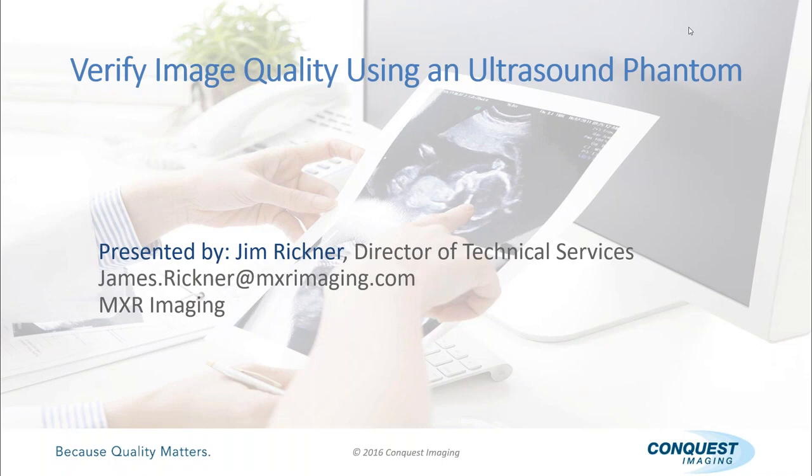And then I had the junior engineer come in from the group and perform his PM testing. Now we're an ultrasound company, and we supposedly train all of our engineers the exact same way. And we got 2 completely different results. And why, you might ask? Well, they didn't use the phantom the way it was intended.